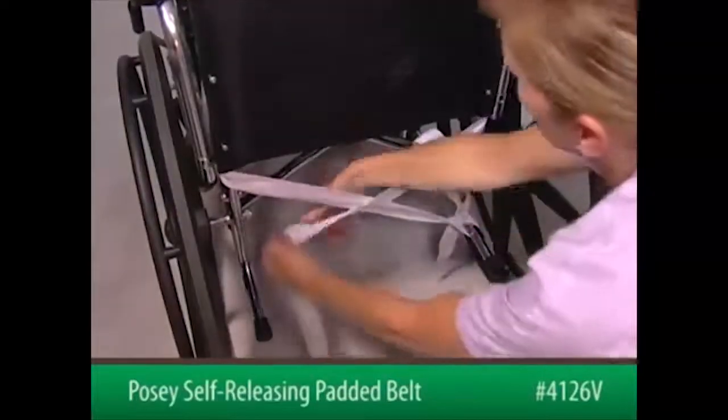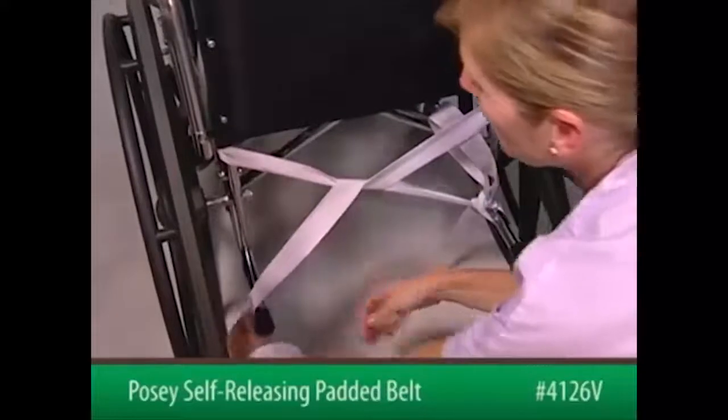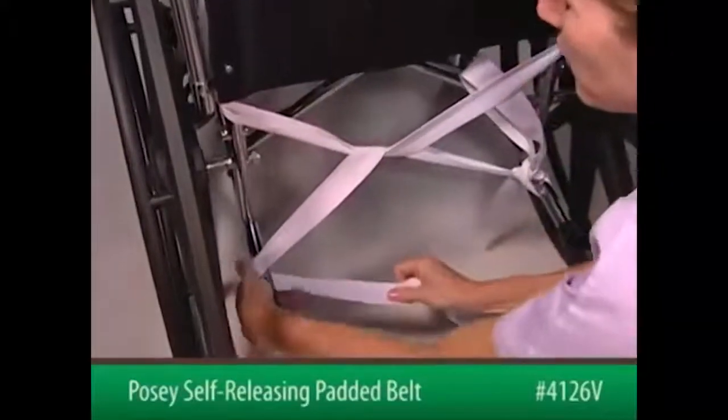Now take the second strap and crisscross it around the first strap and wrap it around the opposite sidekick spur.